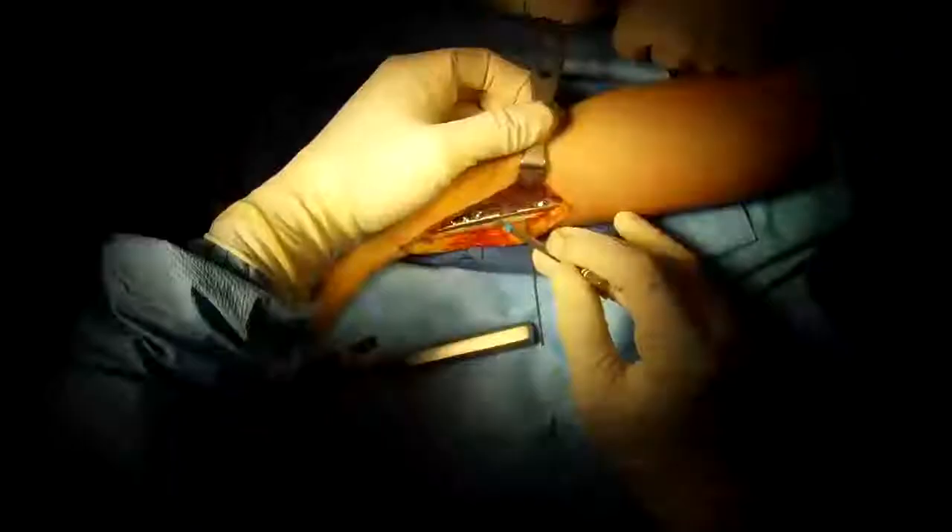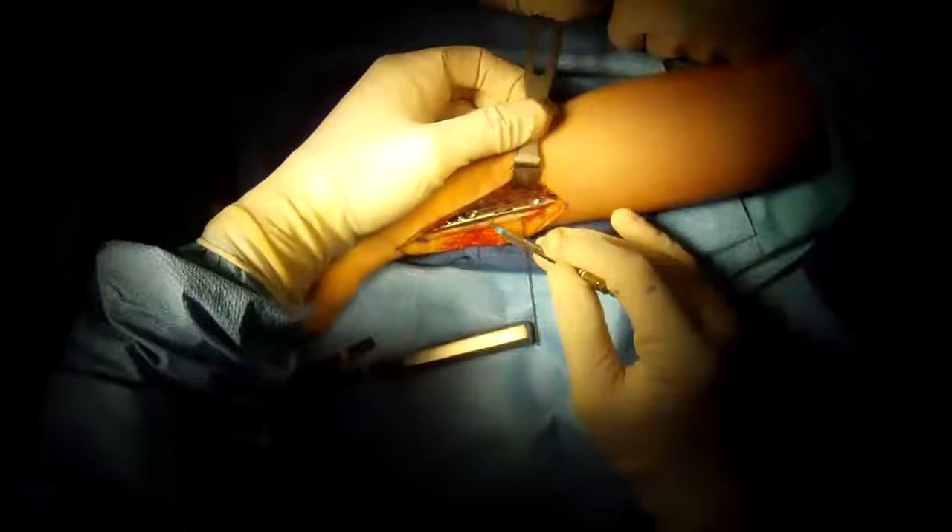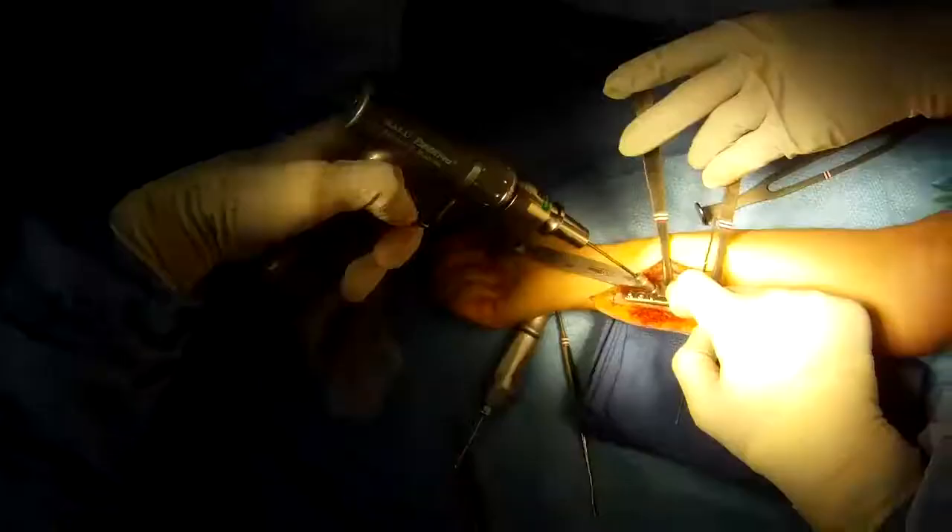The compression is exact. We previously loosened the screw that was in the slotted hole, and now we re-tighten it to hold the plate down. You can see you can't even get a small blade into the osteotomy site — it is exactly opposed.